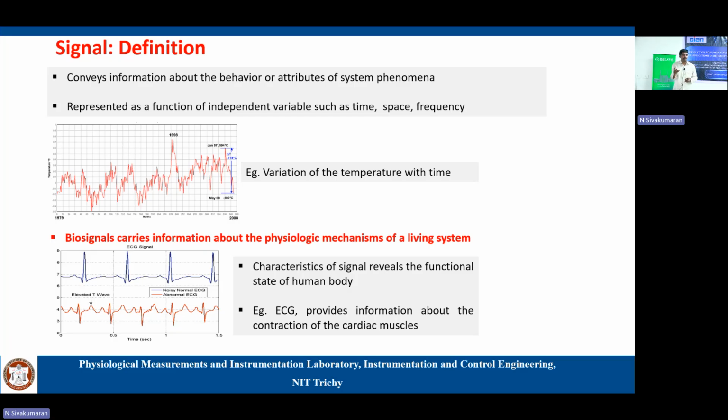The heart beats roughly 72 times per minute, so it should pump the blood. That mechanism we can get to know from cardiac MRI. So apart from the structural information, if you incorporate time, then it becomes 3D, right?